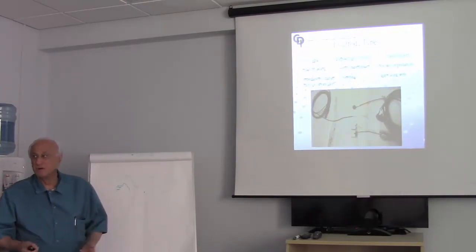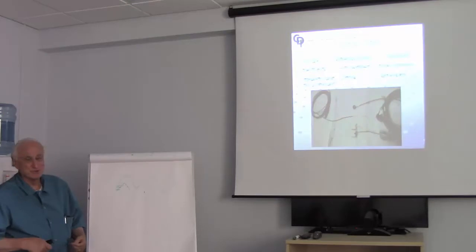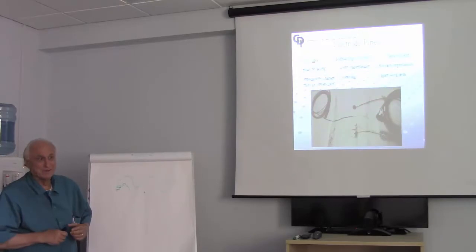We use them everywhere. We use them for EMGs from the ocular muscles. We use them for recording evoked potentials. We use them for stimulating evoked potentials. To us, they're a workhorse. They have very good impedance properties. The negative side is they may cause a little bit of bleeding.